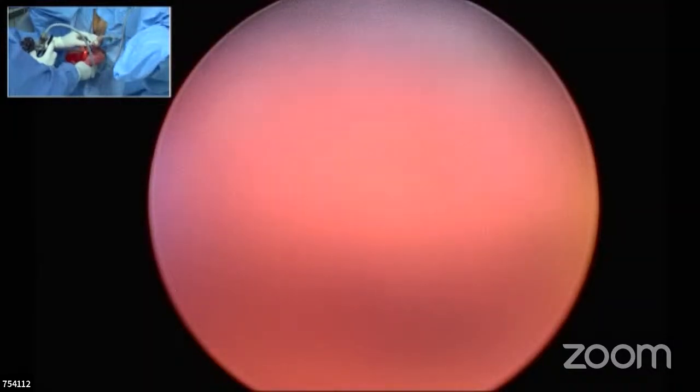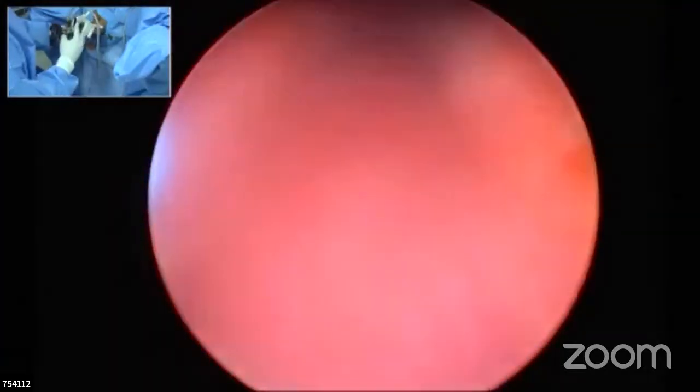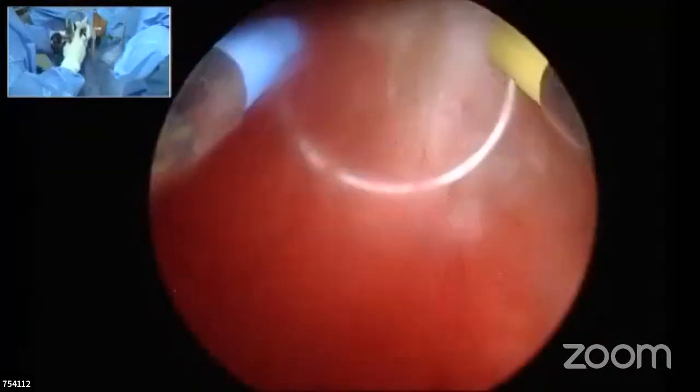Comment, sir. Mallikarjun, it is not called toileting. It is the shaving. Blandy's book, you can go back. He called it a shaving of those small chips here and there. Yes, sir. That's shaving. That's better wording.